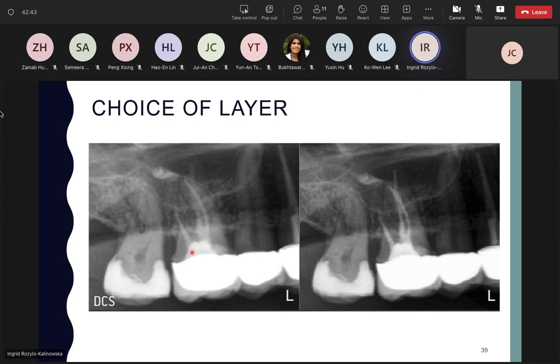And in order to see them separately, the doctor scrolls in the image. So, for example, in this side, you can see the mesial-buccal roots clearly, but the palatal root is not very well visible. But if you scroll towards the hard palate side, you can see the palatal root with periodontal ligament space, but not the buccal roots in focus.